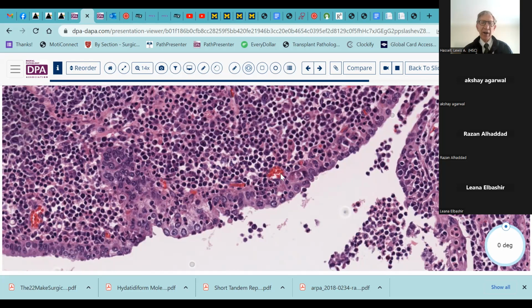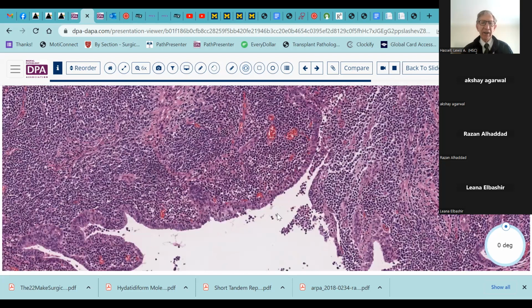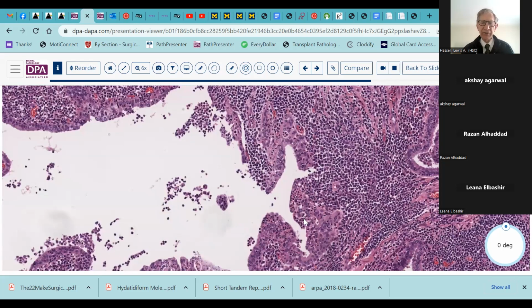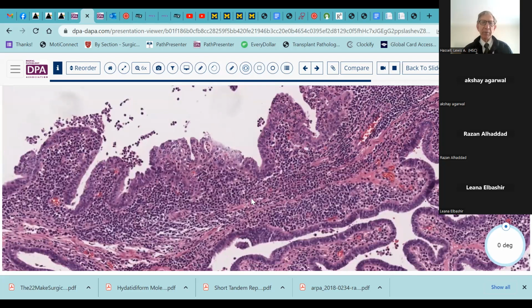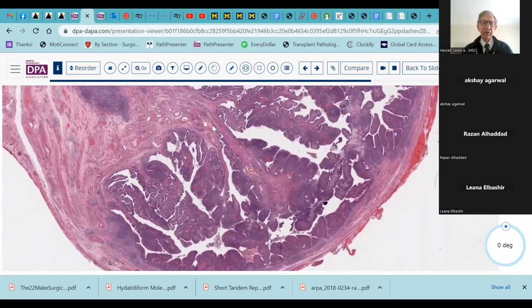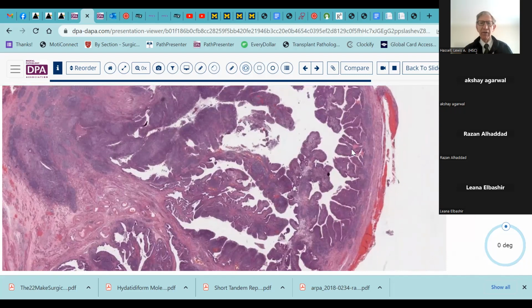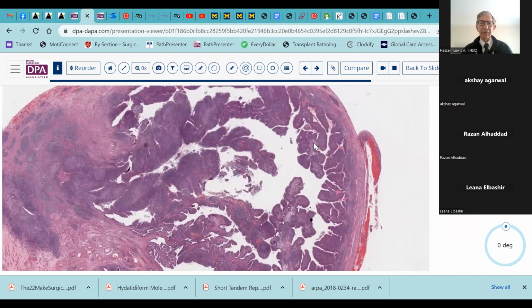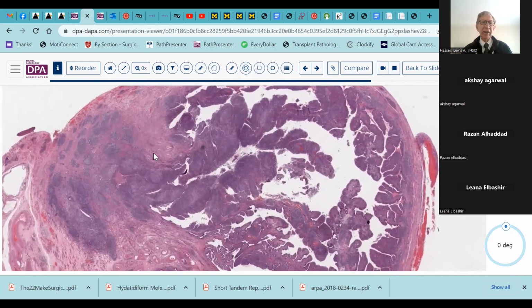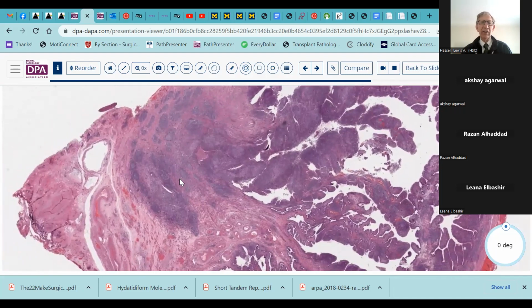So while in other organs you might define this as being lymphoepithelial lesions, it doesn't necessarily imply in the fallopian tube that you've got a lymphoproliferative disorder, because this can happen with chronic salpingitis and long-standing pelvic inflammatory disease. But the history here might become important. One thing that might help you to distinguish this from lymphoproliferative disorder is just the nature of how this blue inflammatory process seems to be quite densely associated with the subepithelial space here. And while there's some expansion of the villus structure in the fallopian tube, it's not particularly distorted, a little bit distorted here. And you don't have too much in the way of progression towards a soft tissue mass.